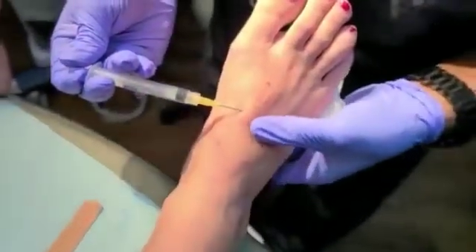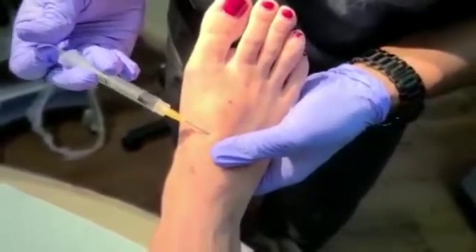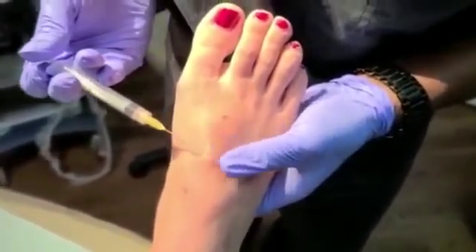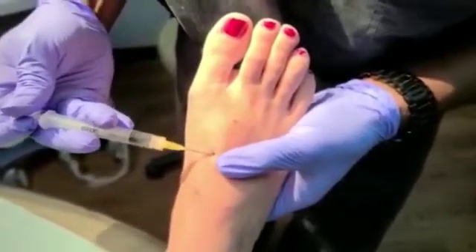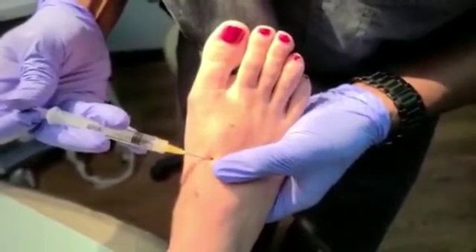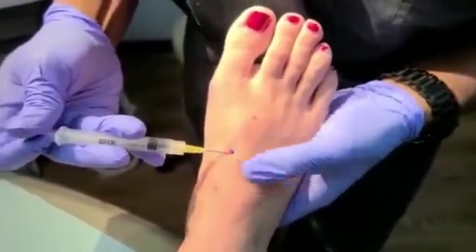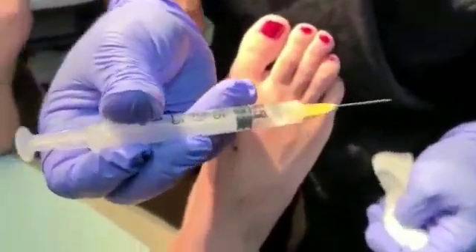It'll feel like a gelatin or gelatinous material. Sometimes it comes out all in one; sometimes we have to push it out almost like a pimple — just manipulate it a little bit more. You can start to see it coming right now into the syringe. Massaging — basically breaking up that gelatinous material with my thumb, massaging it out. You can see that blue circle of where that original lesion had been — it's no longer prominent. Our patient is still doing good. So we're going to take that out. You can hear that vacuum — there's the gelatinous material from the cyst.